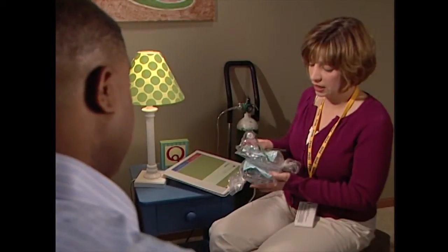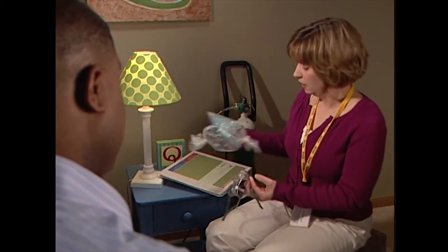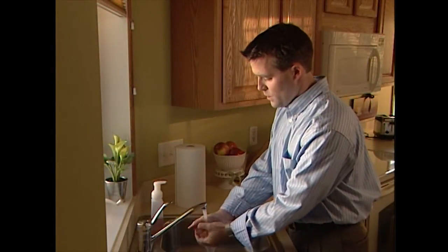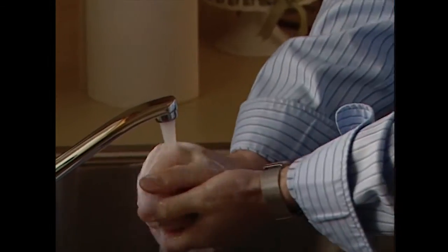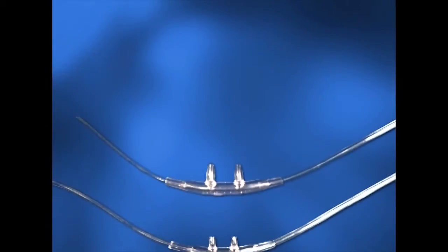In this section you will learn about the different connection devices used with oxygen. Always remember to wash your hands before setting up or changing out your child's cannula, simple mask, extension tubing, or inline adapter.